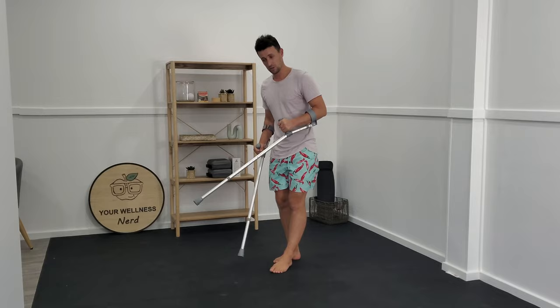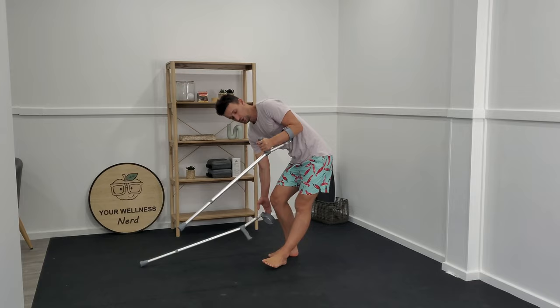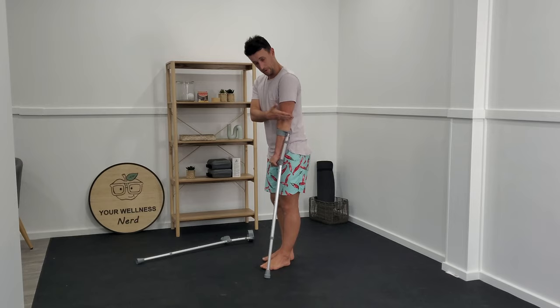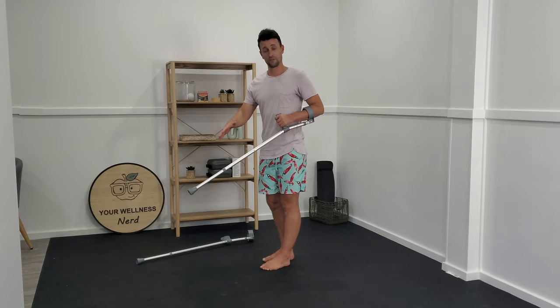The second part of fitting an elbow crutch is making sure that the elbow component is also comfortable for you. We just want to make sure that the actual ring that you put your elbow into isn't coming up towards the end point of your elbow. But as long as you feel like you've got the length of the crutch from handle to floor optimized for you, you can then play around with what feels most comfortable over time.